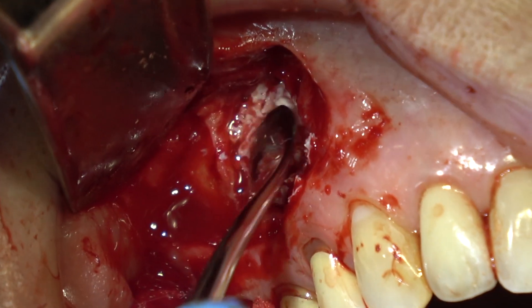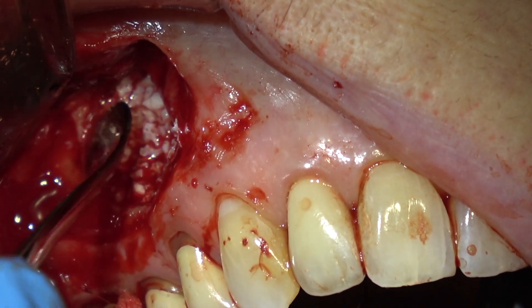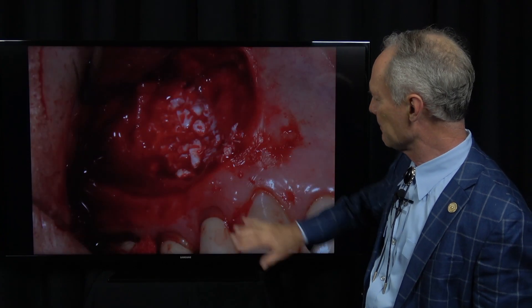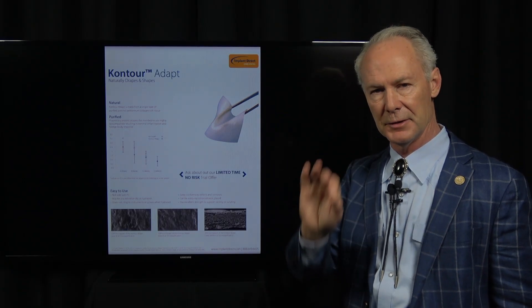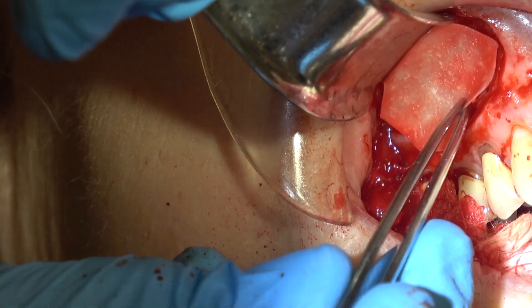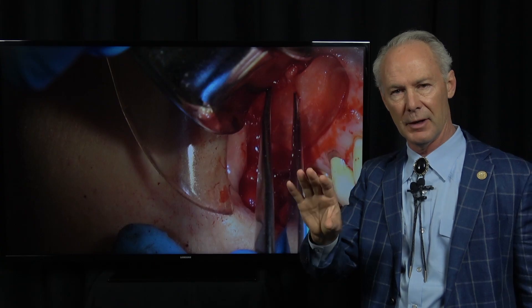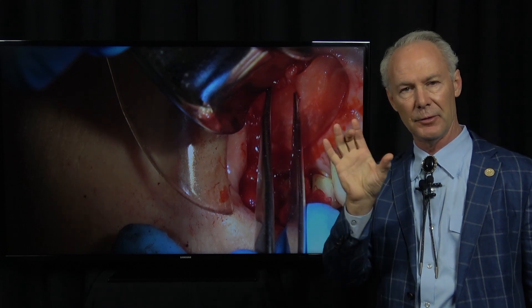You can see how I've filled the apical part of the canals. Now I'm filling in the lesion with freeze-dried bone. You can use either Maxi freeze-dried bone or, in this case, Biowass — it's a mix of mineralized and demineralized freeze-dried bone. It's very important you put a collagen membrane on top of this to give the bone a head start on the soft tissue. The soft tissue grows faster than bone, so it blocks the soft tissue and gives bone an equal start, so the lesion fills up with bone and not soft tissue.